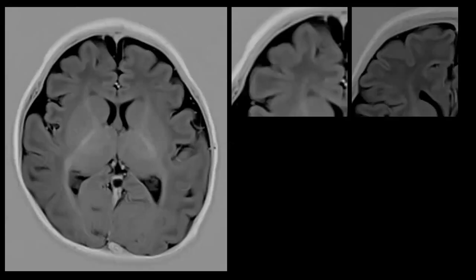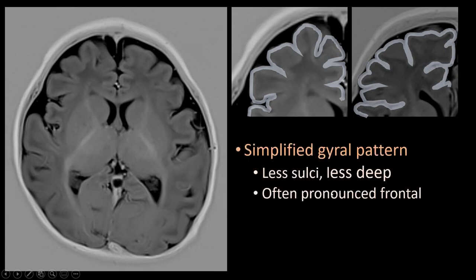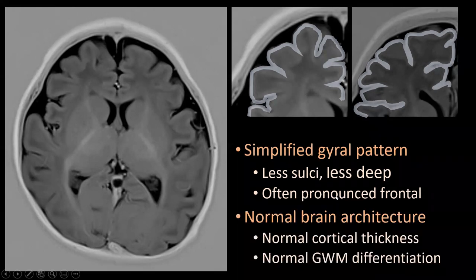How would you describe the difference? Looking at T1-weighted inversion recovery images in magnification and comparing the gyri and sulci, we see fewer sulci in the child with microcephaly, and they also appear a bit less deep. So we see what is called a simplified gyral pattern — fewer sulci compared to a normal child. This is most often most pronounced in the frontal lobes. Apart from that, the cortex is perfectly normal, with normal cortical thickness and normal gray-white matter distinction.